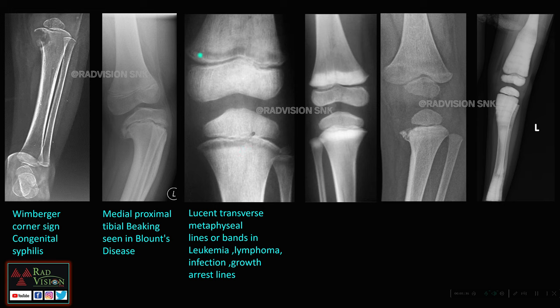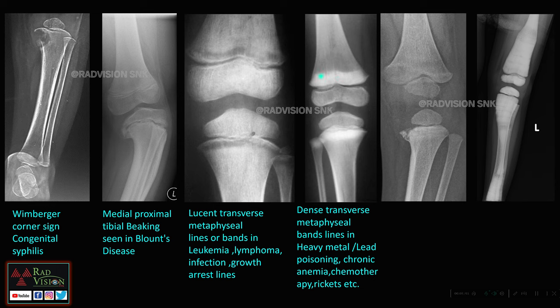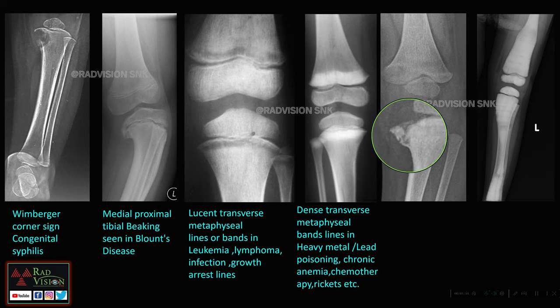These are lucent transverse metaphyseal lines or bands. Next, dense transverse metaphyseal bands are commonly seen in heavy metal poisoning or lead poisoning, chronic anemia, chemotherapy, rickets, etc. Here you can clearly see this is a metaphyseal corner fracture.